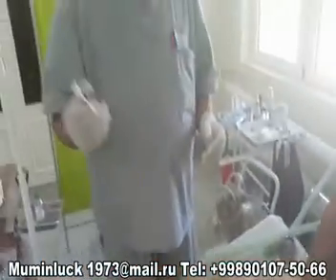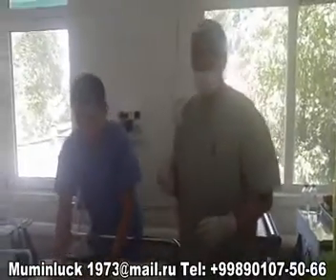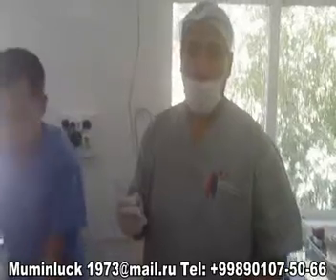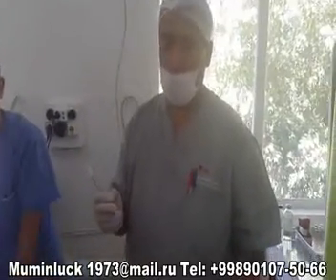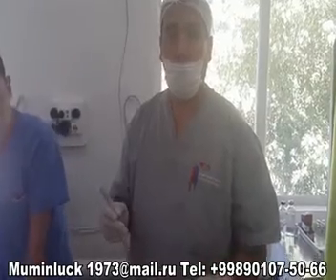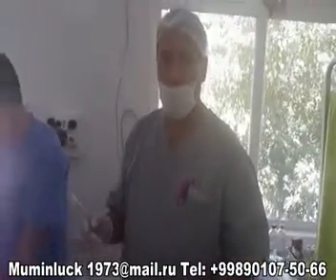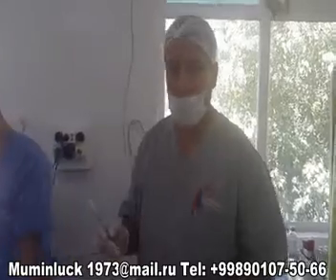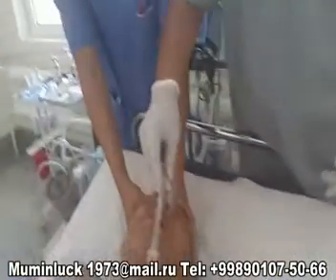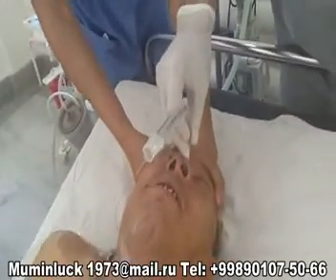For blocking the nasal mucosa, we usually use ten percent lidocaine spray at the nostril and on the tracheal tube. After the tube reaches the oropharynx, we inflate the cuff of the tube — this results in raising the tip of the tube toward the vocal cords. Before inserting the endotracheal tube into the trachea, we use the so-called air probe: moving the endotracheal tube forward and releasing it to feel the patient's breathing.